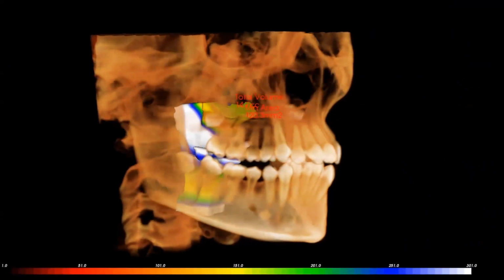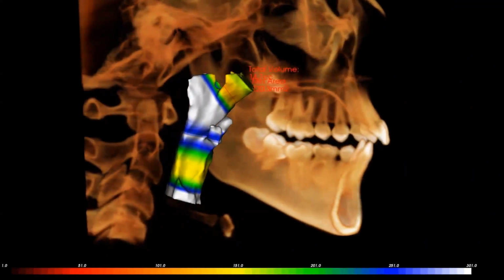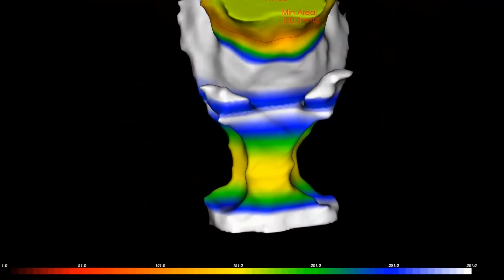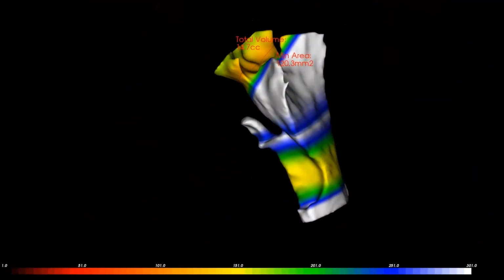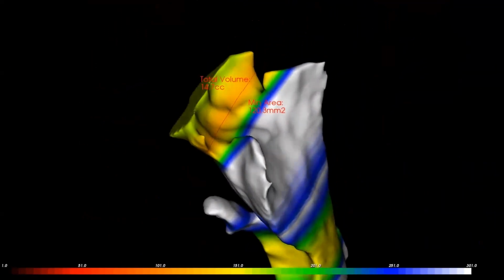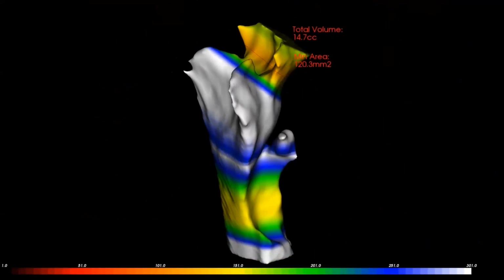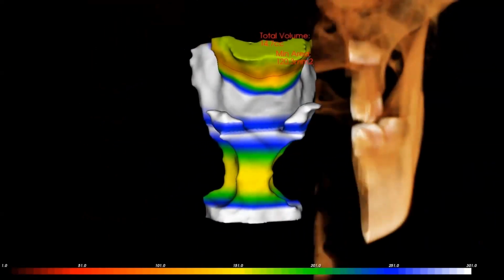Cool 3D visual of this from the software where we see the tonsils pinching in laterally and then also the adenoids at the top. And so this airway's compromised in multiple dimensions. And then that's the best case scenario. Then they sleep and relax. They breathe through their mouth and the mouth opens and falls back. And now the tongue's going to push it back even further. So it gets pinched in from all sides.